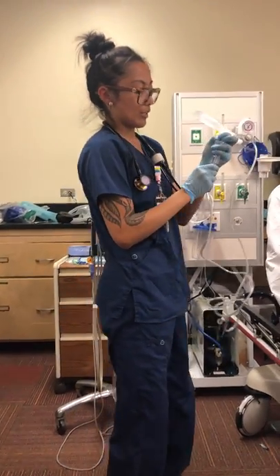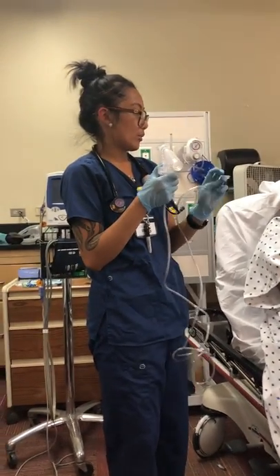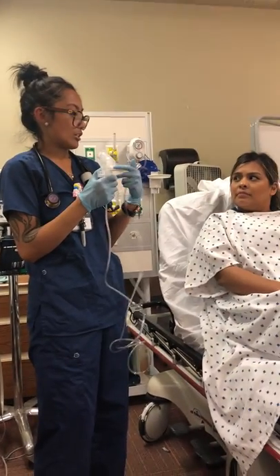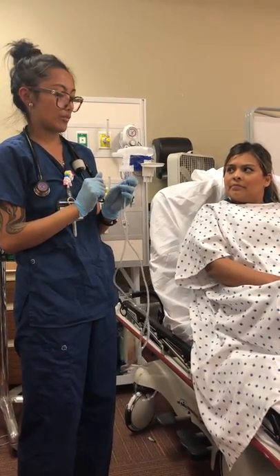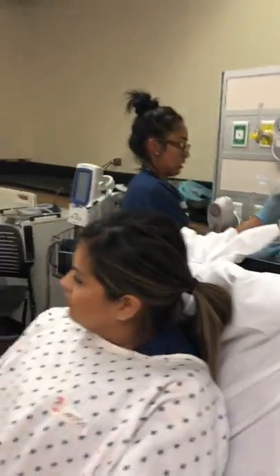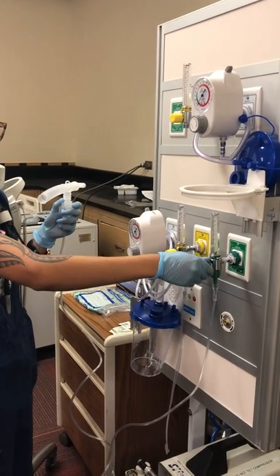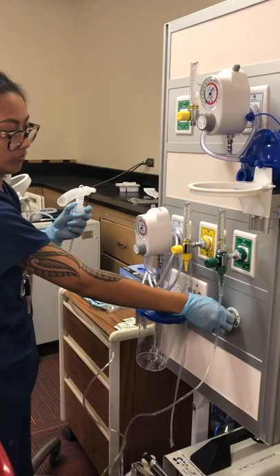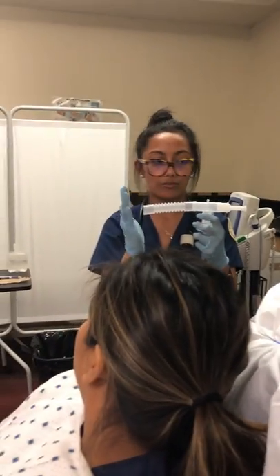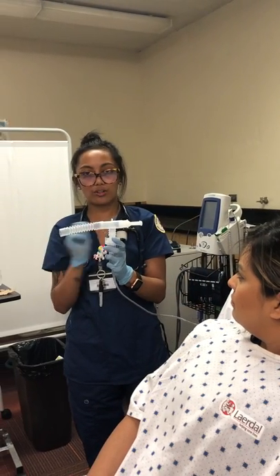When using the small volume nebulizer, I'm going to have you create a tight seal with your teeth and lips around the mouthpiece, and then breathe in normally. Periodically I'm going to have you take a deep breath to get the medication deep down into the bases where I heard the wheezing, then breathe out and continue breathing normally with deep breaths every once in a while. I'm going to hook this up to the wall with the medical-grade oxygen set at 50 psi, then turn it on to 6 liters per minute. I'm confirming air is coming out from the mouthpiece, and I can see the aerosol forming.